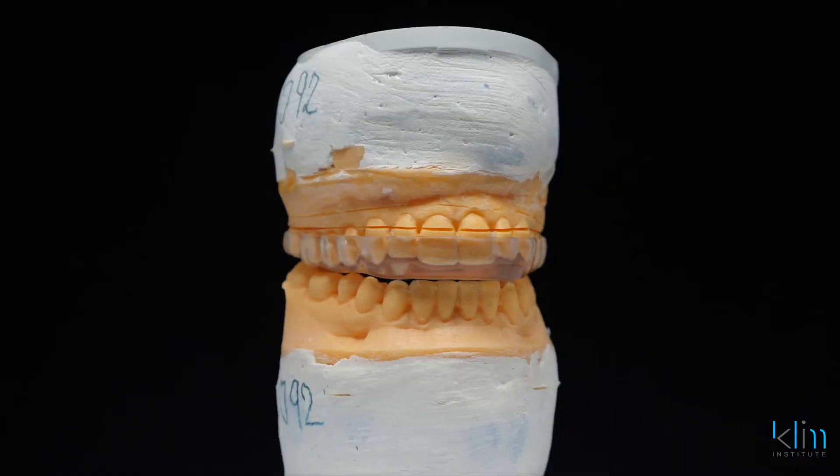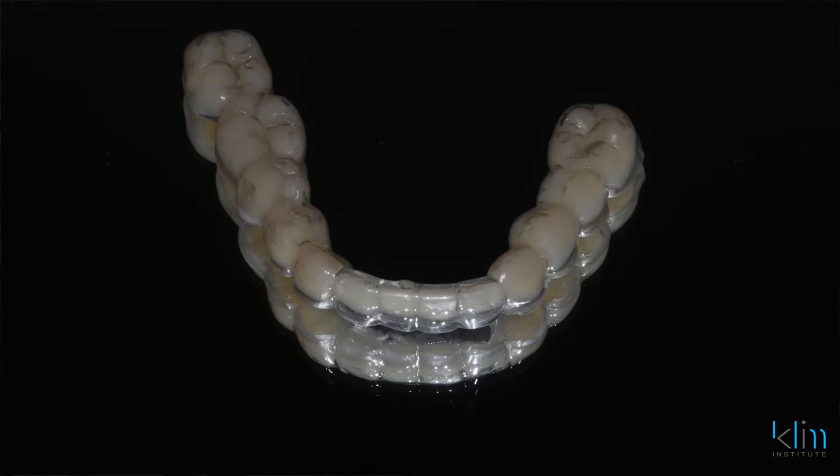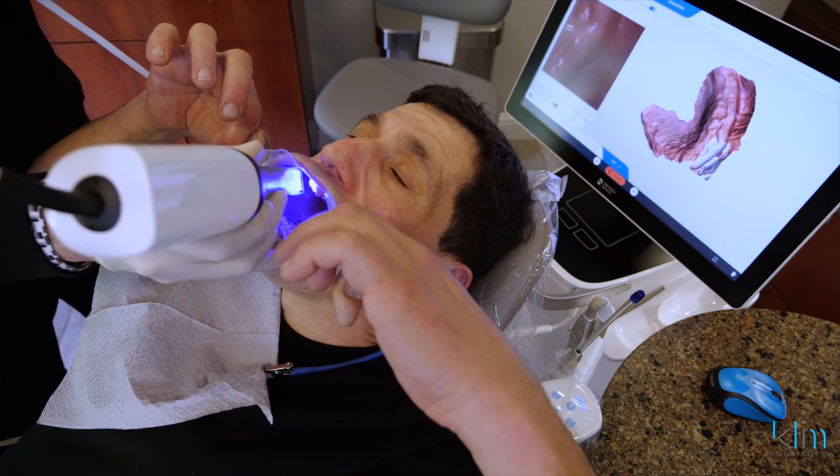There are so many other things we can do with PrimeScan. I very rarely do analog impressions anymore — appliances, aligners, orthodontics, sleep appliances, you name it. How about impressions for the edentulous ridge? Yes, the PrimeScan does that so well.